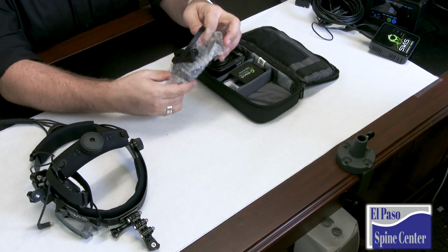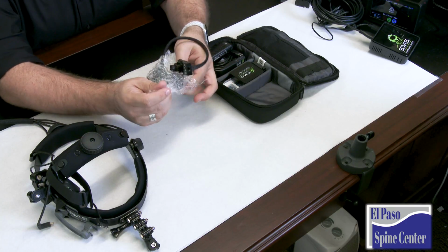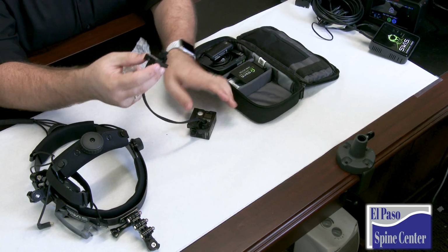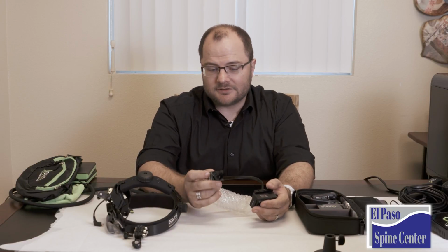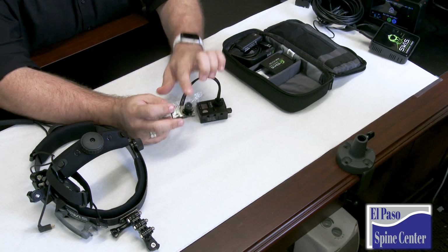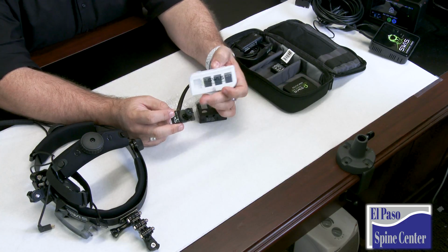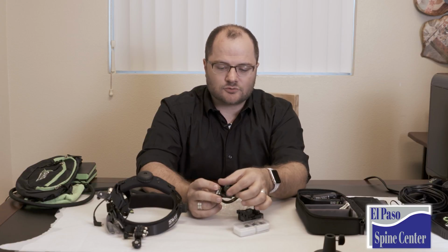Probably the primary component, and the first thing that should stand out to you, is the GoPro with the lens system and sensor on this cable. It's a pretty cool little system. They're not the first people to do this, but it is a system that works really well. The lenses, I'm going to move that around. You do actually get a set of lenses, which you can simply unscrew from here. They unscrew and you can screw back on.